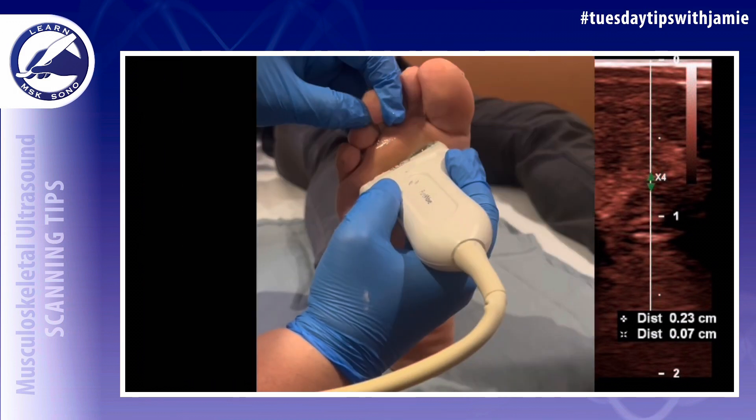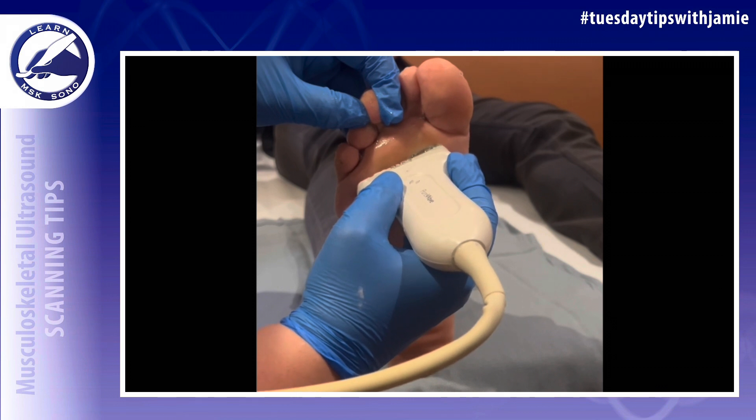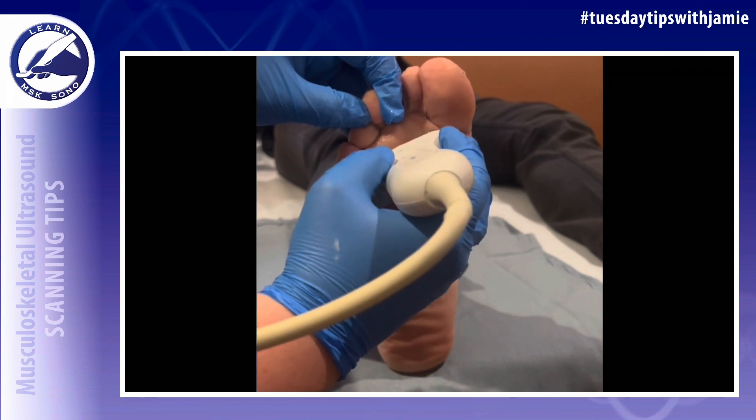Five, once the MTP joint is visualized, heel the probe to align it with the toe and eliminate anisotropy of the plantar plate.